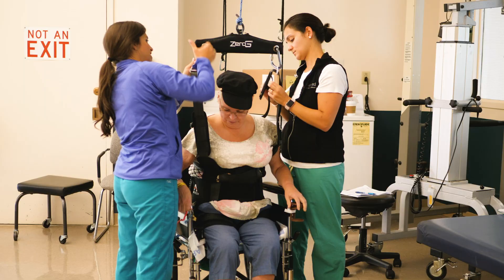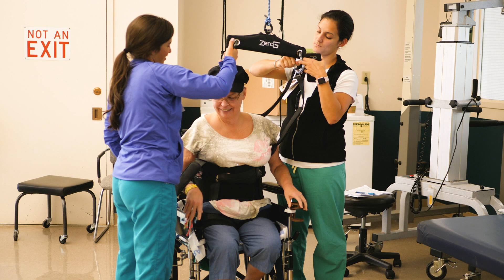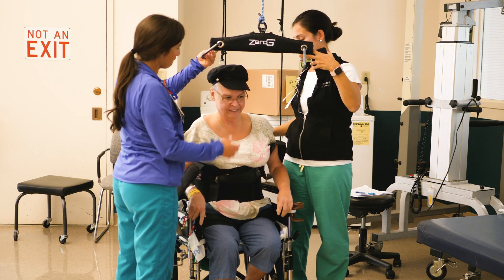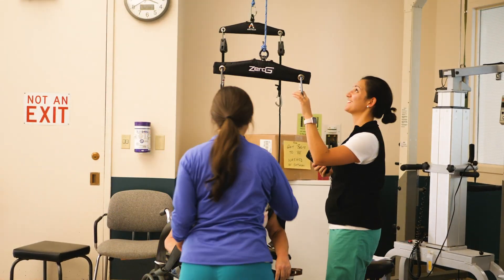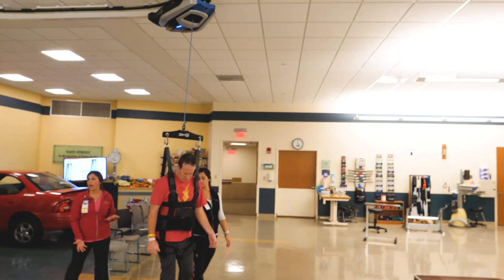We've used it with all of our patients here at Gaylord Hospital — from our pulmonary patients, patients after a traumatic brain injury, stroke, spinal cord injury — really it can be used with any patient population. We have pulmonary patients, spinal cord injury patients, brain injury patients, and our general medical patients. We have a high stroke population as well, so we really do use it amongst everyone here in the hospital.